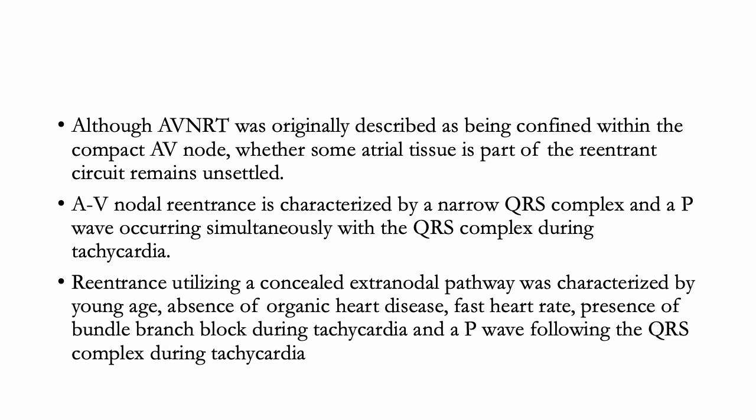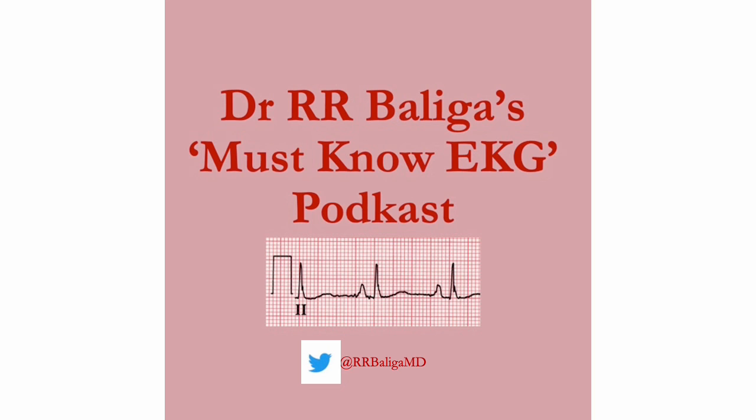Reentrance utilizing a concealed extranodal pathway was characterized by young age, absence of organic heart disease, fast heart rate, presence of bundle branch block during tachycardia, and a P wave following the QRS complex during tachycardia.